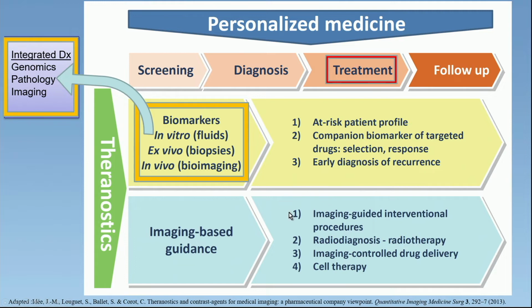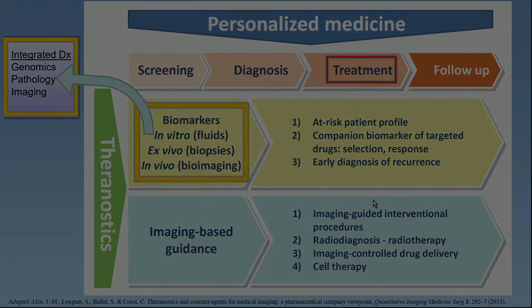And we also slot very nicely into imaging-based guidance for therapies and treatment, right? Of course, interventional radiology can play a big role there for image-guided therapies, but we can also collaborate with our radiation oncology colleagues to do radiodiagnosis, and they can do targeted radiotherapy. Nowadays, there's even imaging-controlled drug delivery. We're placing catheters, for example, to deliver radiopharmaceuticals in clinical trials, and cell-based therapy. We can play roles there to determine if we can target cell-based therapy correctly.